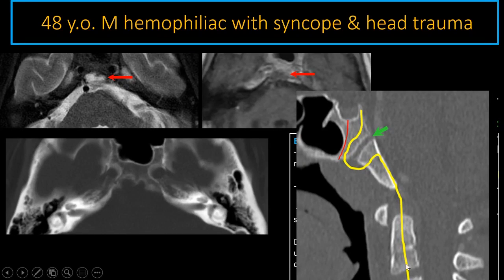So this is just a diagram reminding us of this sigmoid course of the notochord extending through the clivus. And so you can have this benign hamartomatous lesion typically seen along the dorsal margin of the clivus associated with ecchordosis physaliphora.